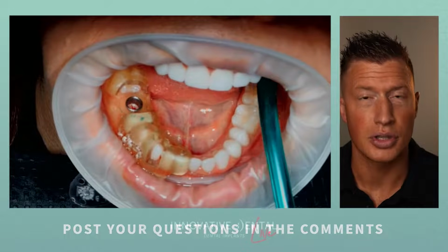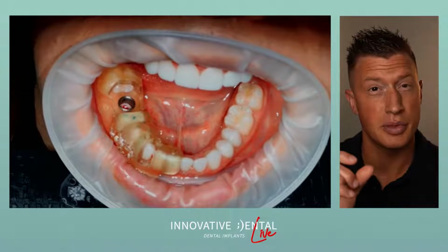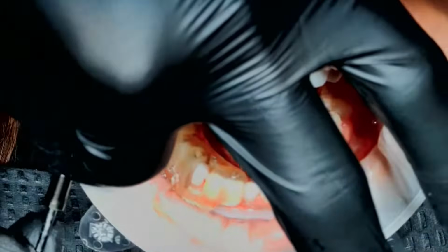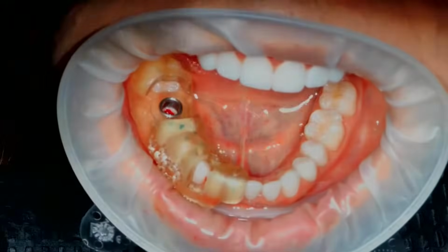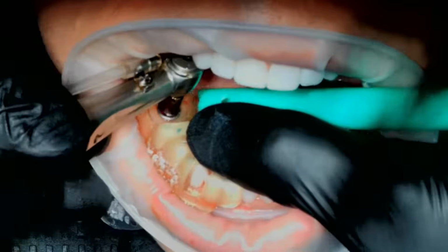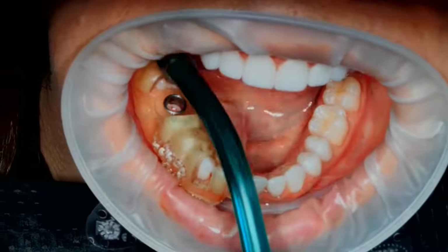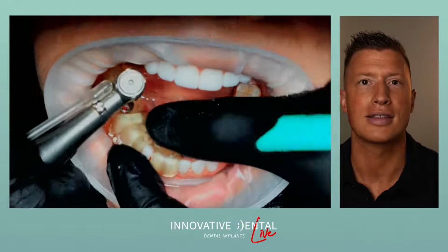There was the pilot drill. The pilot is going to be a 2 millimeter diameter pilot. It's usually 6 millimeters in depth. And I believe this implant I'm placing is a 5x10 implant. So that first little pilot was a 6 millimeter. This next one's going to be an 8. That's what I'm showing right there. And then I'll use a 10 millimeter pilot. I said 2 millimeter diameter, but 6 millimeter length, 8 millimeter length, 10 millimeter length. So guided surgery allows us to incrementally increase the length, the depth of our osteotomy, safely.